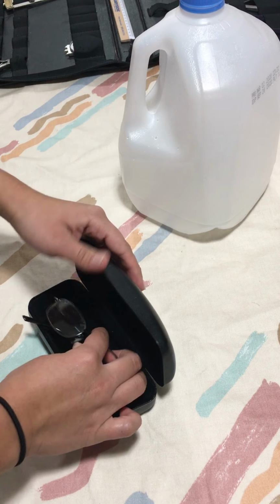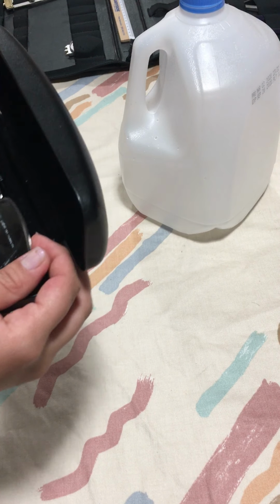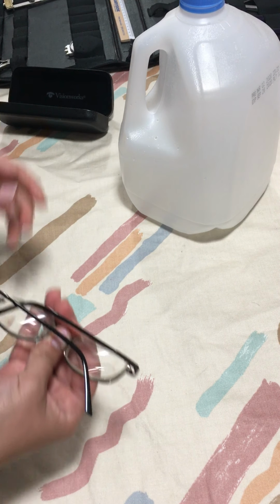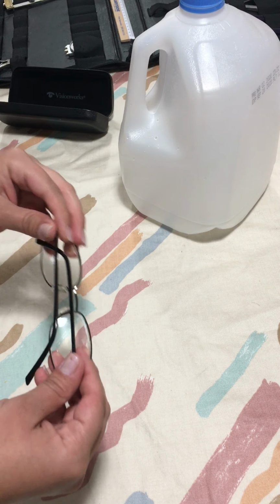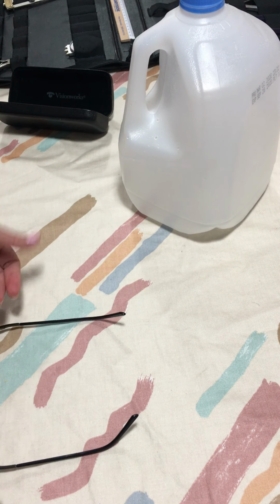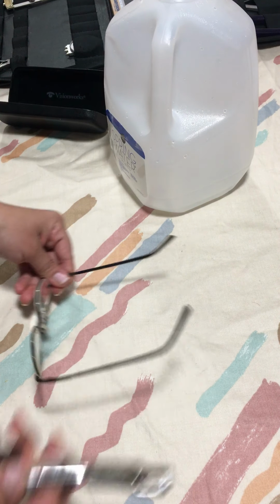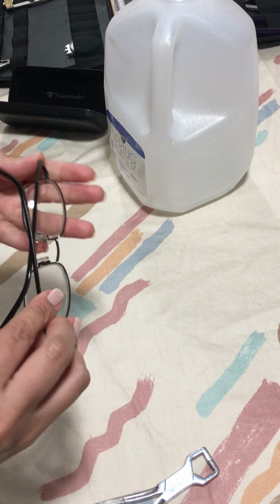So that patient comes in, he gets his case. It doesn't close on the case. They complain. This is what the patient sees. Okay, so what we have to do, since we know that it doesn't have any more adjustments on the frame, we have to use our wide angling plier. Okay, we're gonna close it.